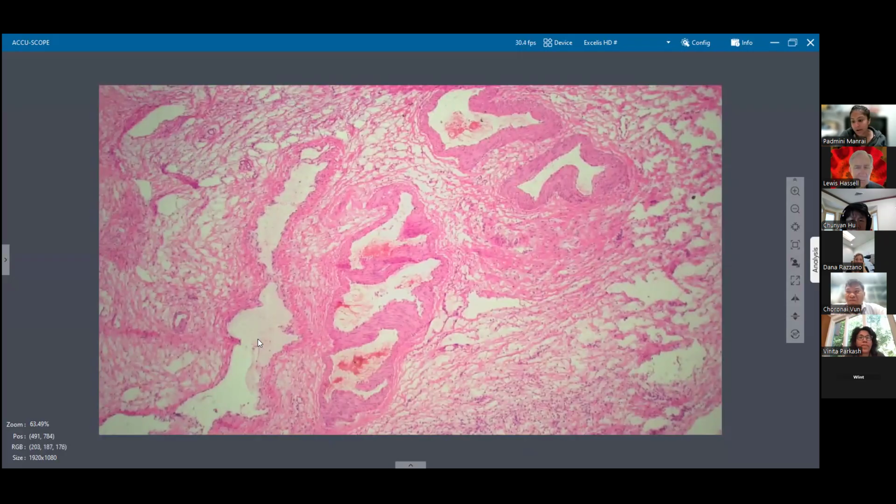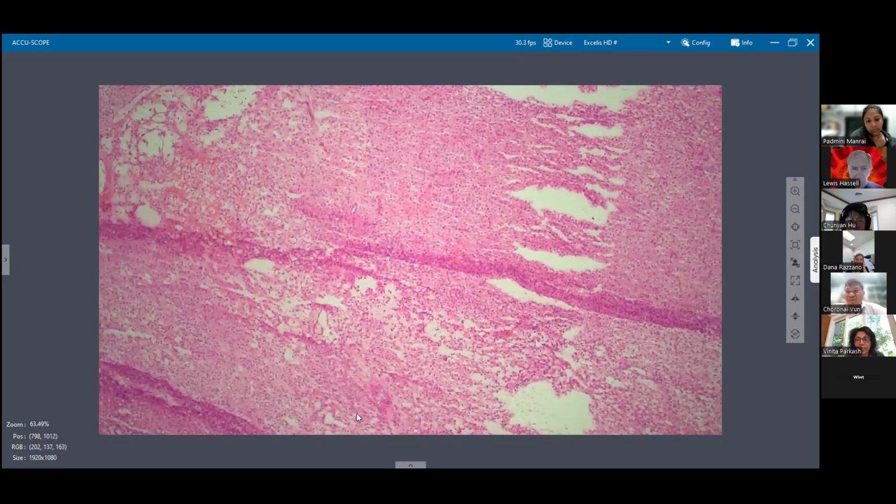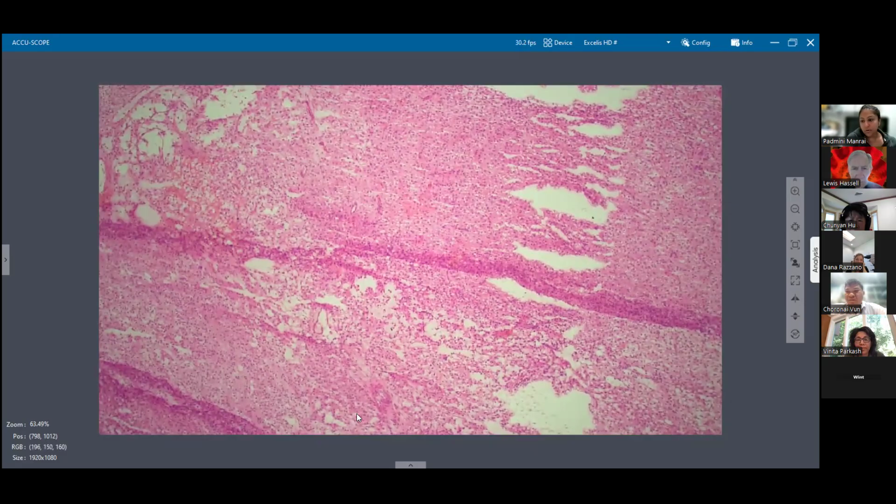The other thing to think about is a pregnancy luteoma, because they can look very similar, but those typically occur in the 3rd trimester. So if they had told me that about this patient, I mean, usually we don't see those on frozen. Sometimes they're going in after a C-section and they take it out. But those are just things to think about. And like you said, no significant mitotic activity, no significant atypia within the nuclei, and not really a lot of necrosis. Those are all good things that point me toward benign.